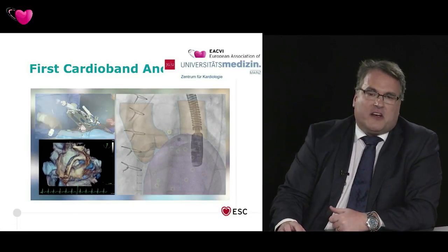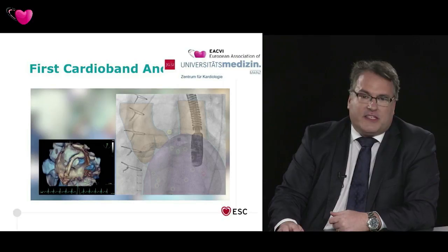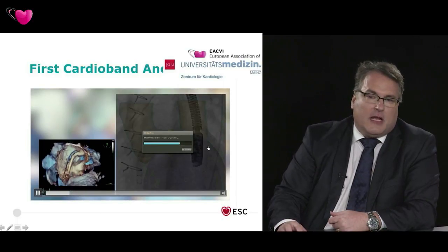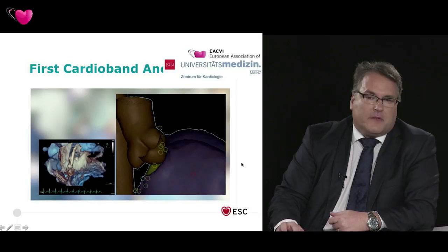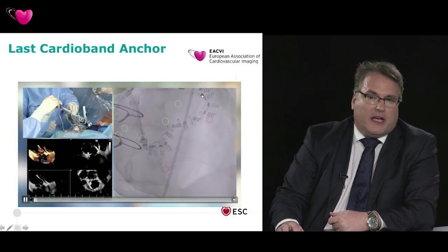But here we use the heart model to directly do an intervention. So we steer it to the muscle. And this phase here is the left ventricular muscle, and below is the chamber. And by doing this, we can intervene, and after some procedural steps, you see here the whole cardioband being deployed.